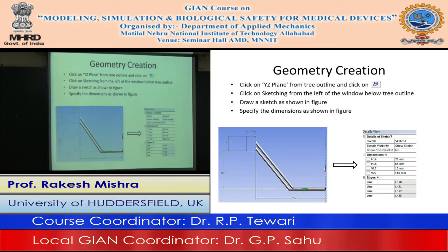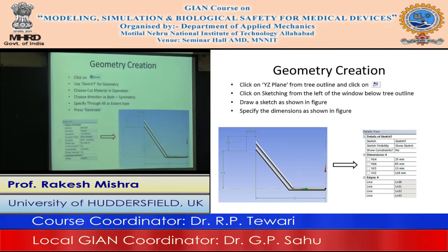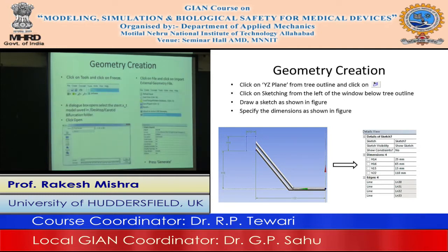Now the next part is more important, is putting stent in one of these. Okay, a stent has been created. I have provided you file. So let us see how do we bring a stent here inside the artery. So what we do, we freeze all this, then we go to file, we go to import external geometry file, and we choose stent x underscore t file, and we import it into the view.